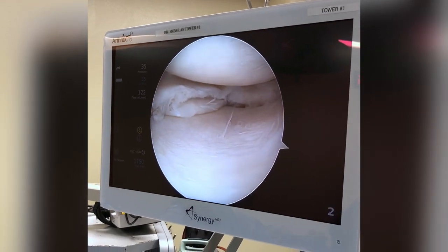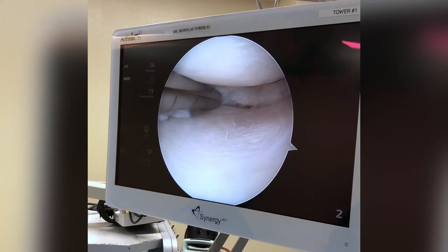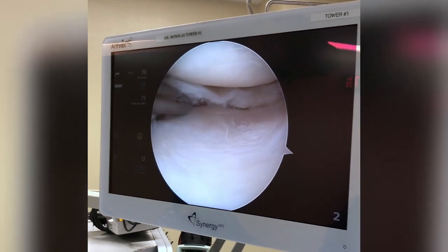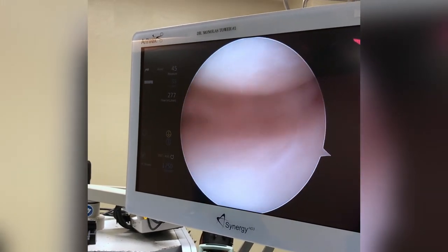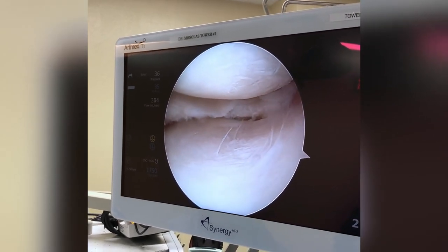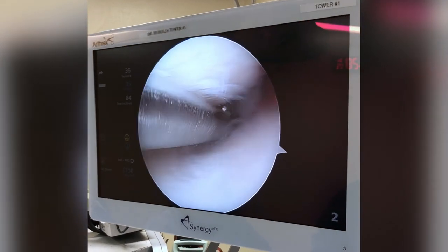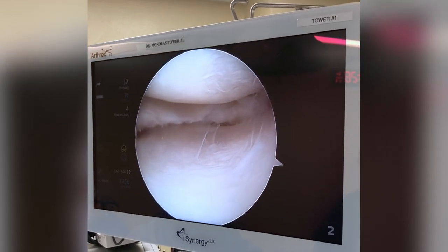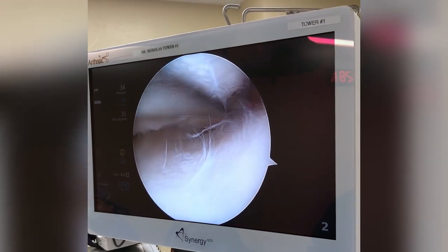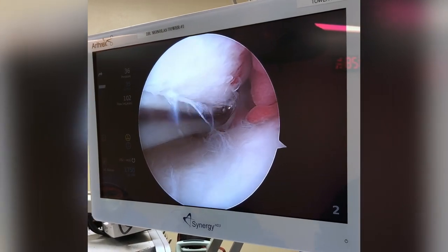Try shaving — that might be better. The shaver is better. I believe we're in position now where we can save the rest of this meniscus, and I think it'll be good and work out well.